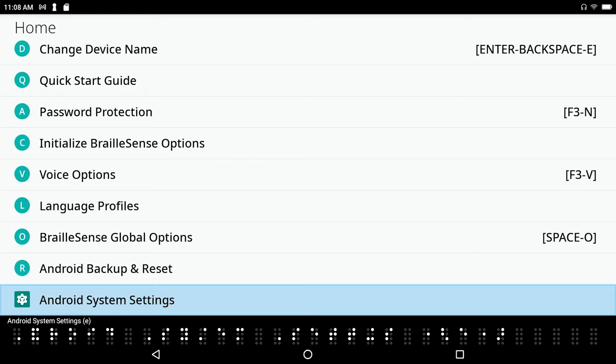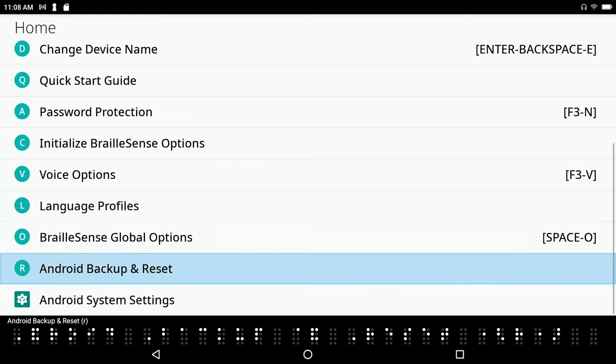Because I know that down towards the bottom here, Android backup reset R, we've got an Android backup reset that will not do any good in regard to saving a backup in the hopes of putting it on your Braille Sense 6, so let's not bother with that.